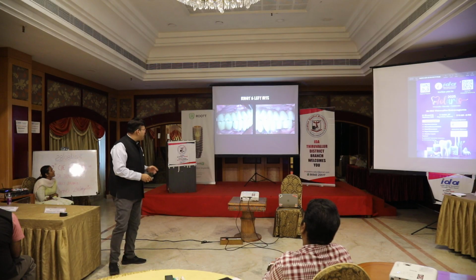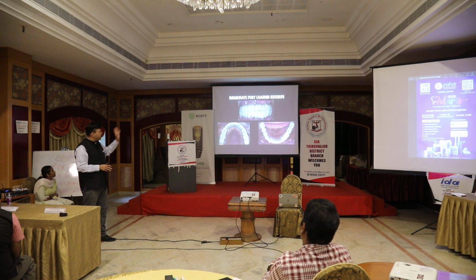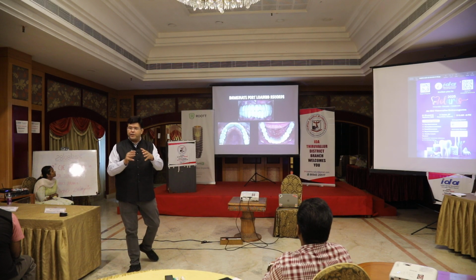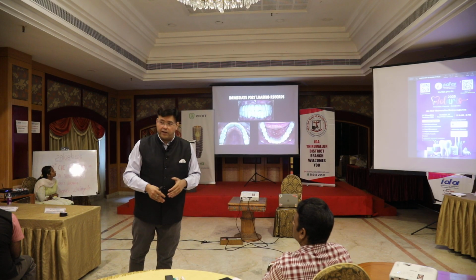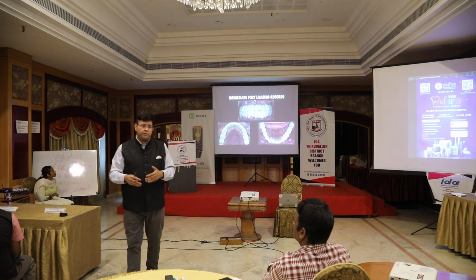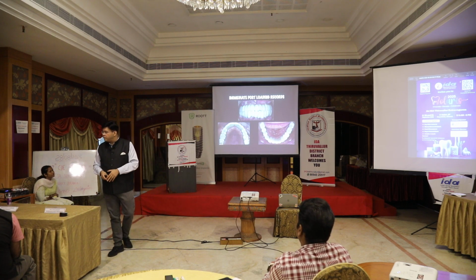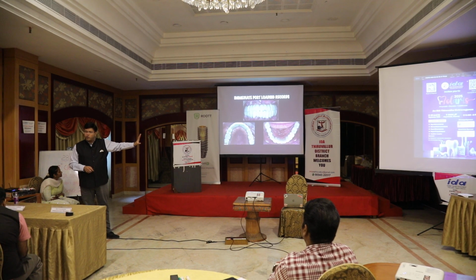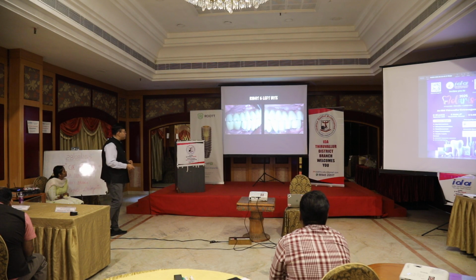So this patient had this prosthesis done by one of our course participants, and this patient was wearing this for around 2 months. But he was not very happy. He used to keep saying that there is some sound that comes, he's not able to chew well. So our friend used to do all this adjustment, but it was still not very satisfactory. When you see this at the outset, it looks okay, it's not bad. The lower anteriors were natural crowns, and in the posteriors they had implant supported restorations.